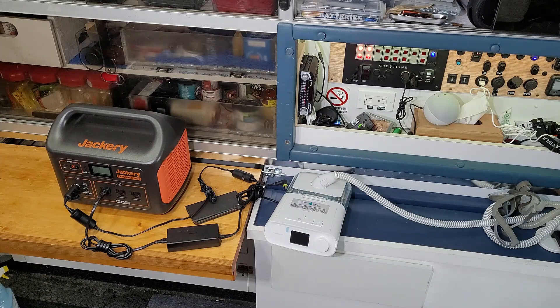I borrowed a Jackery 1000 from a friend so I can do some comparisons from my CPAP from AC current draw and DC current draw. When I was on the island I lost my voltage controller for my solar panel, and this would be something I really would have liked to have when I was traveling on the road.